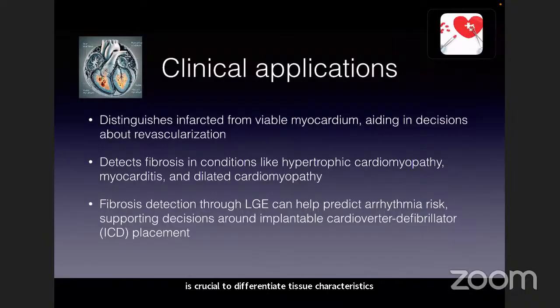Clinical application. Distinguish infarcted from viable myocardium, aiding in decisions about revascularization. Detects fibrosis in conditions like hypertrophic cardiomyopathy, myocarditis, and dilated cardiomyopathy. Fibrosis detection on LGE can help predict arrhythmia risk, supporting decisions around implantable cardioverter defibrillator.